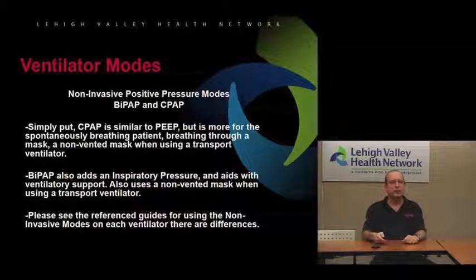You really need to go through the reference guides for the non-invasive modes for each ventilator to truly know what the differences are, and actually spend some time playing around with the ventilators at the bases to figure it out.